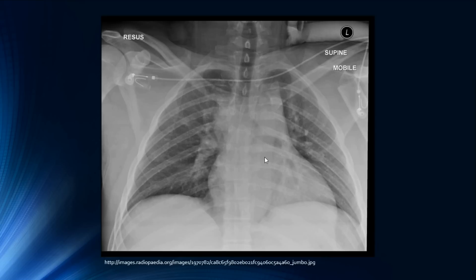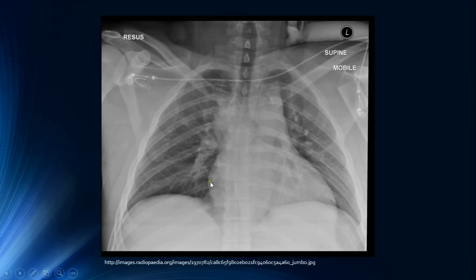An interesting fact: this chest radiograph belongs to the same patient as the previous PA view, demonstrating that this patient and this chest radiograph is actually 100% normal.